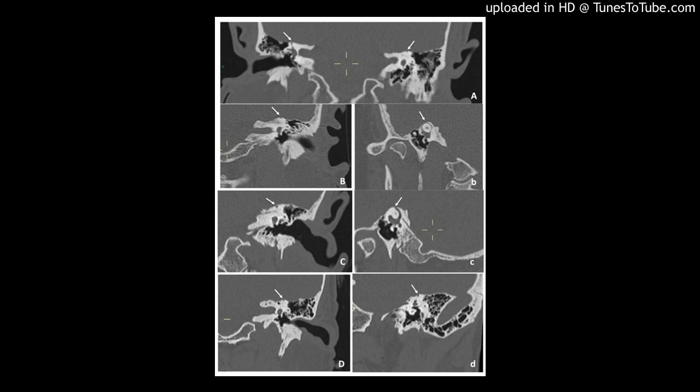Figure 6. Both ends of the superior semicircular canal are obliterated with muscle, posterior end dashed arrow, A, and anterior end white arrow, B. Figure 7. Both sites are covered with fascia, marked with X, A, and then with bone pate, B. The operation ends with wound closure in layers.